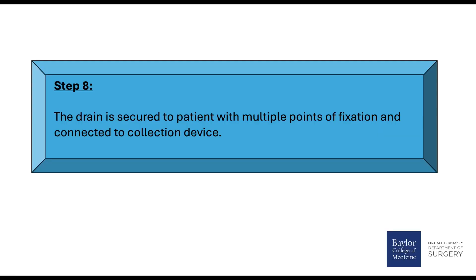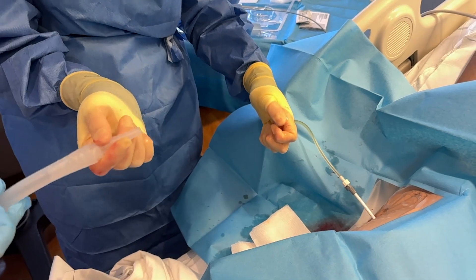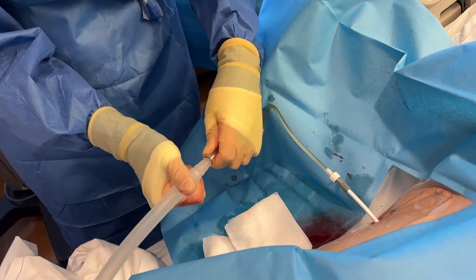Step 8: The drain is secured to the patient with multiple points of fixation and connected to a collection device. The provider confirms: 'I'm going to hook it up to that canister that we talked about before.'